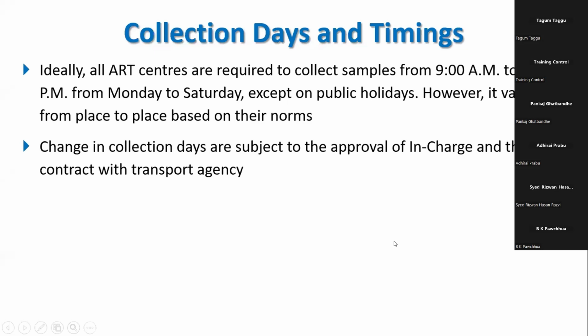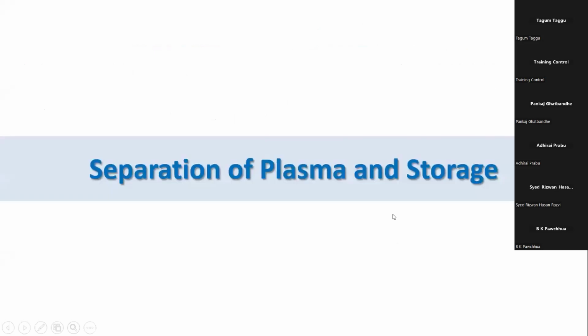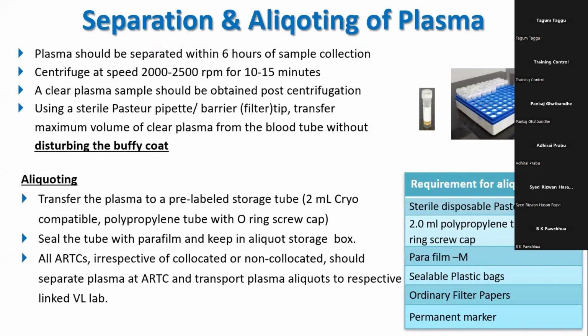Change in collection is subjected to prior approvals from the in-charge, as well as informing the transport agency. So, the storage. Yeah, there is again emphasis on the same point that the whole blood should be separated within 6 hours. 6 hours is the time here.